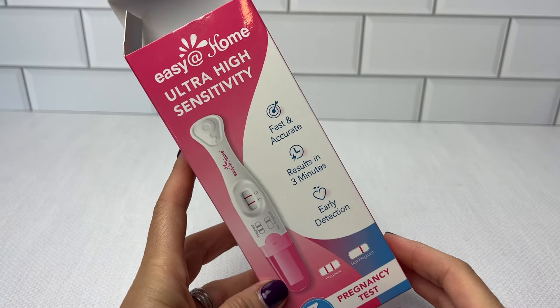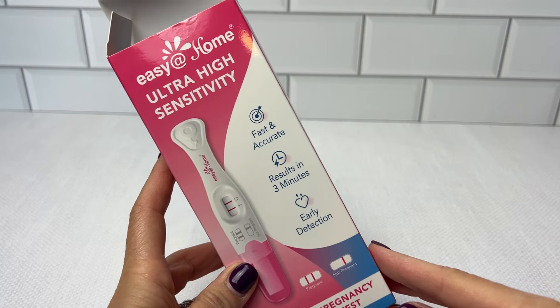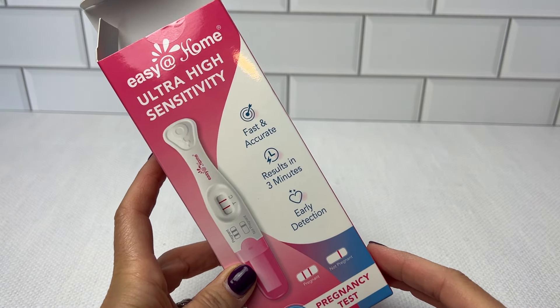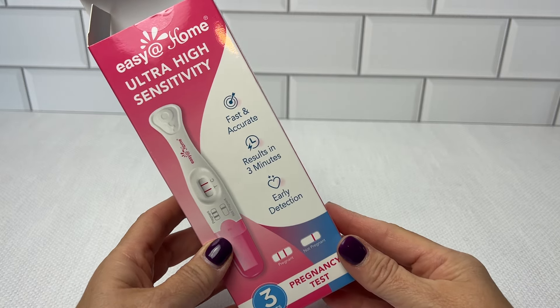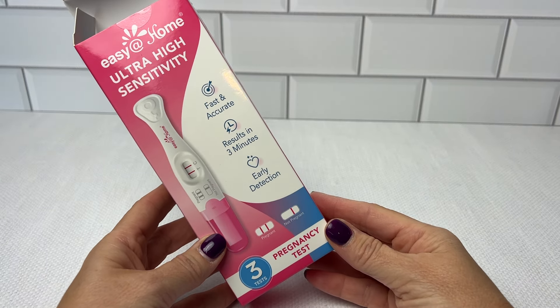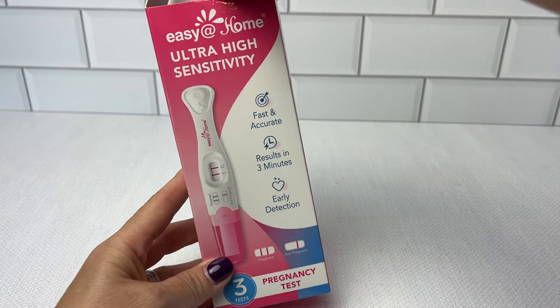Introducing the latest innovation in home pregnancy tests: the Easy Home Ultra High Sensitivity Pregnancy Test. There are three in this box. This new design is a real game changer, offering a blend of accuracy, sensitivity, and affordability, so it's really hard to beat.